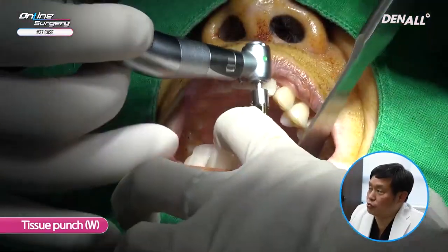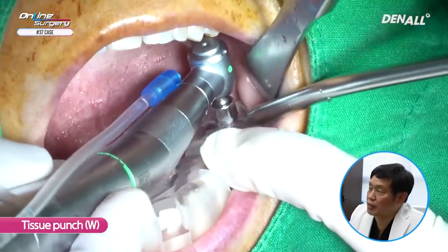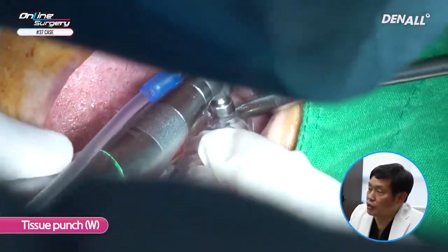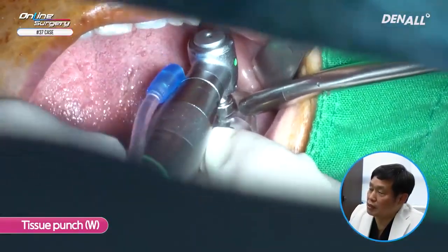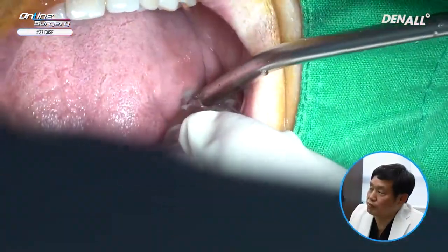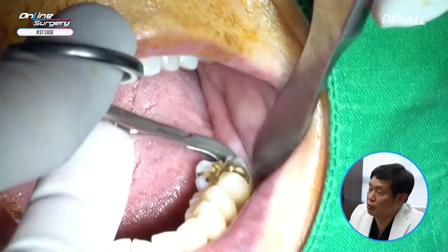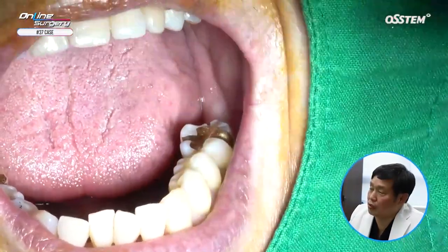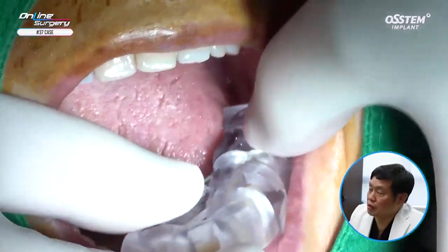Wide type tissue punch is used to remove overriding mucosa. I'm using tissue punch full length. There's no stopper on tissue punch. Overriding mucosa is fully removed. Template is removed. Behind that, I'm removing the tissue which is not fully removed. Template is now positioned.